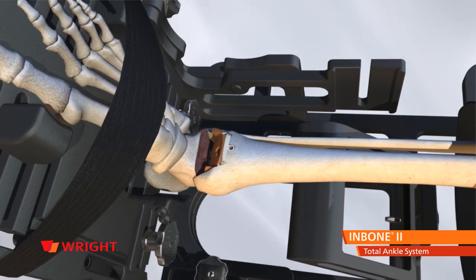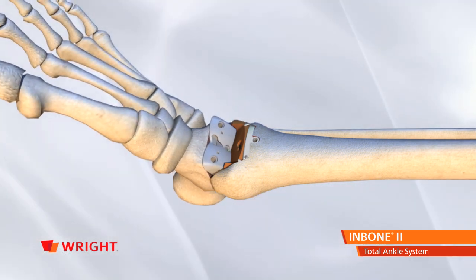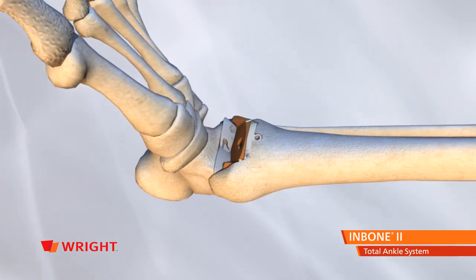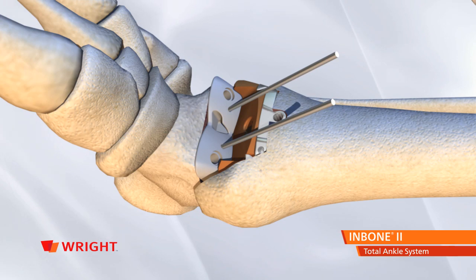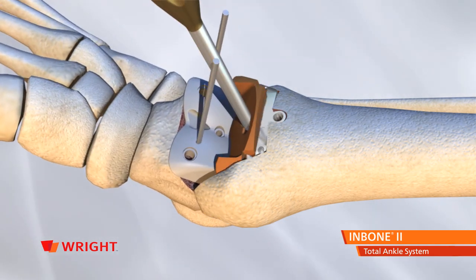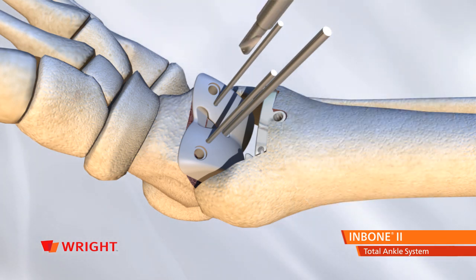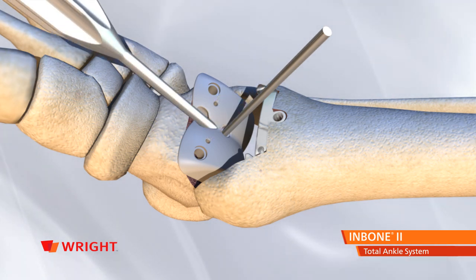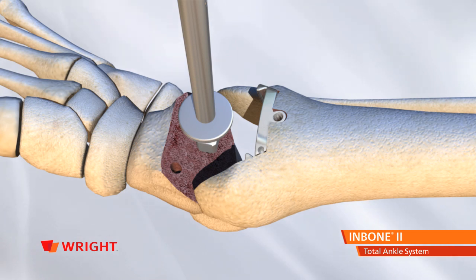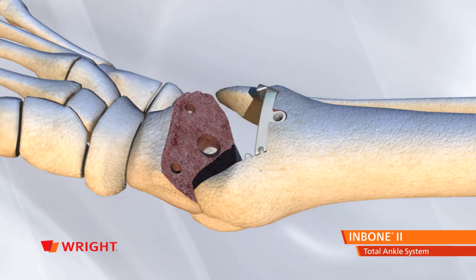Install the appropriate poly insert trial and talar dome trial into the joint space using the corresponding holding tools. Release the foot from the foot holder and with trial implants in place, take the ankle through a passive range of motion. Once the talar dome trial has settled into optimum anatomical position, install two 1.4 mm pins through the talar dome trial to hold it in place. Remove the poly insert trial and install a 2.4 mm pin through the center of the talar dome trial to the depth of the selected talar stem, using the lateral view to verify depth. Using the 4 mm drill, drill through the talar dome trial to prepare the talus for the anterior pegs of the talar dome. Remove the 1.4 mm pins and talar dome trial. Install the appropriate length talar stem reamer over the 2.4 mm pin and ream to the depth of the selected distal stem. Remove the reamer and the Steinman pin.